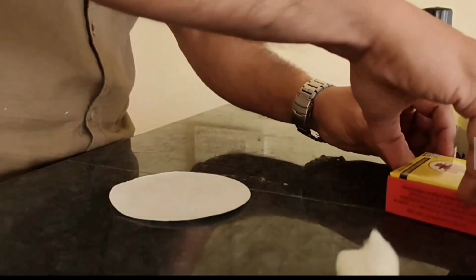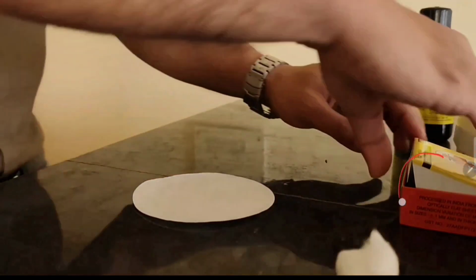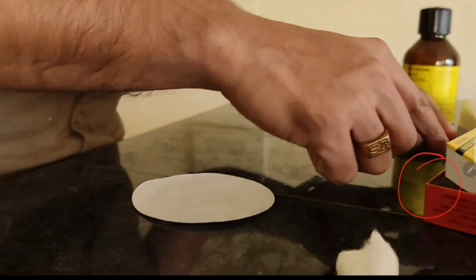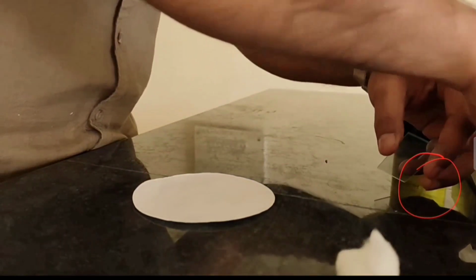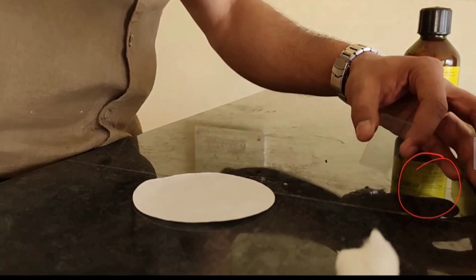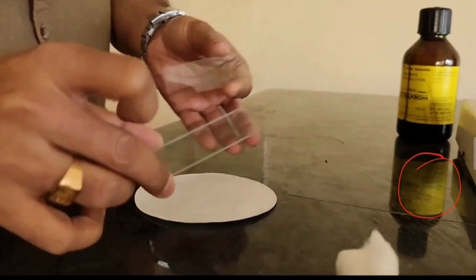We are going to demonstrate the procedure for how to do that. First we are going to use the glass slide. Here we can see we have a glass slide box. This is a new glass slide, so we don't need to clean it and can use it directly. Otherwise we have to. So we are using 2 glass slides.